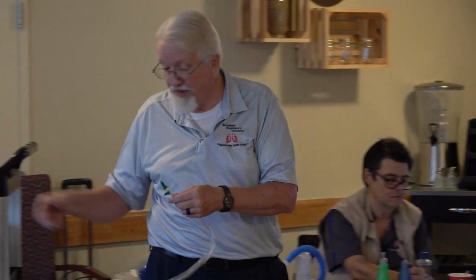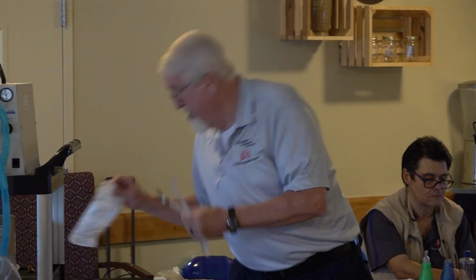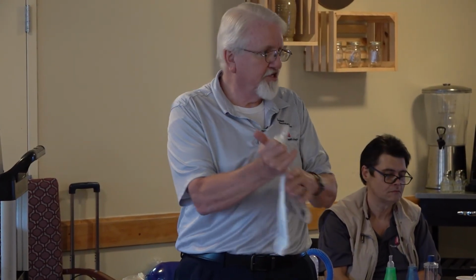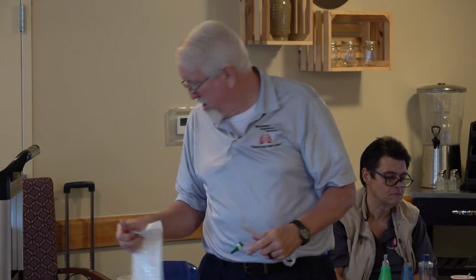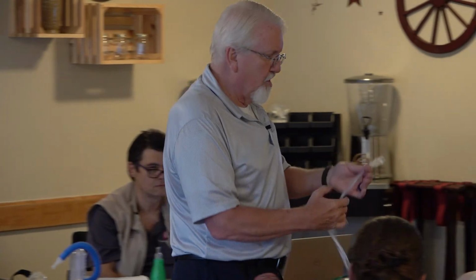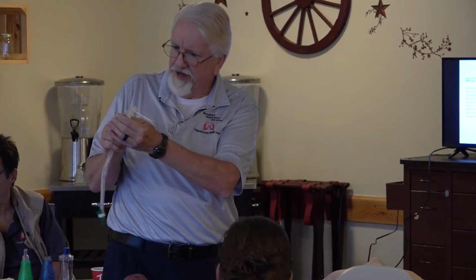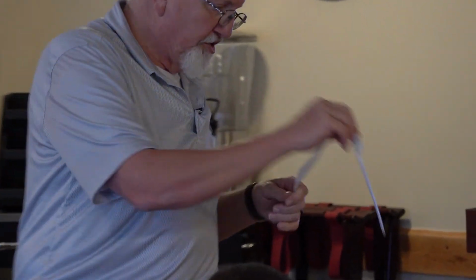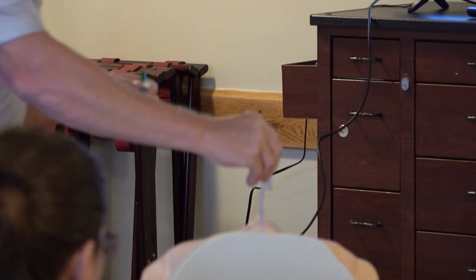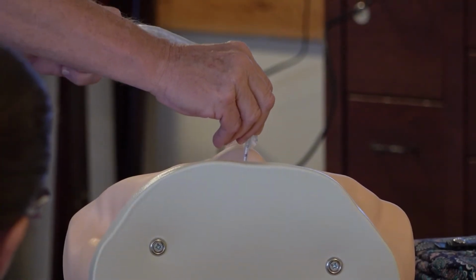Because I'm the one that always changes it out. Again, it's not a sterile process, so it'll already be hooked up to my machine. It'll be folded up in the sleeve and in this pack sitting in the patient's drawer or whatever. When I get ready to suction, same process. No suction on. I'm going to feed my catheter out of my sleeve and I'm going to insert. No suction.